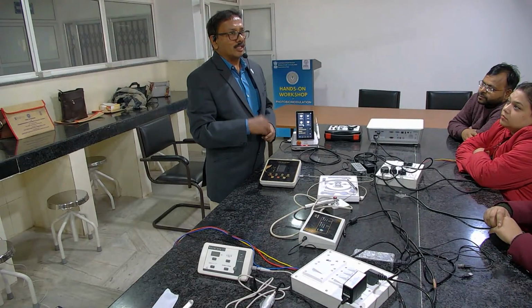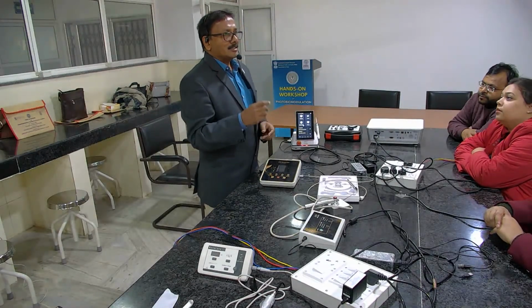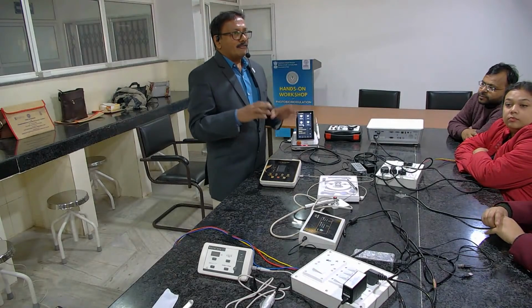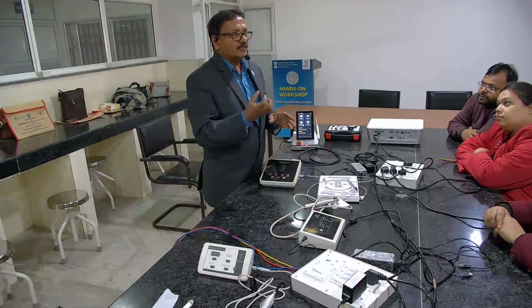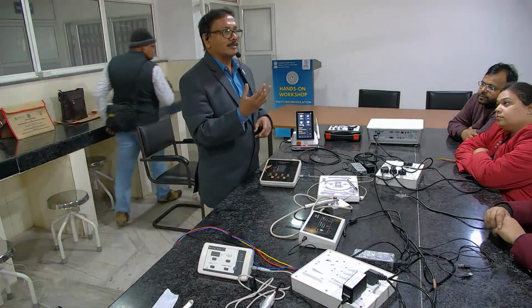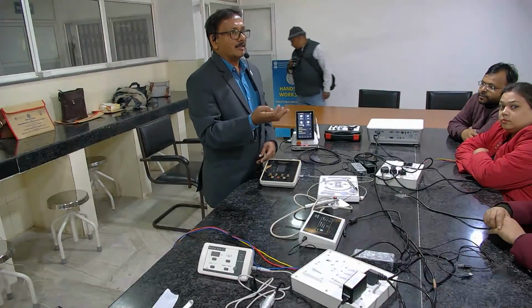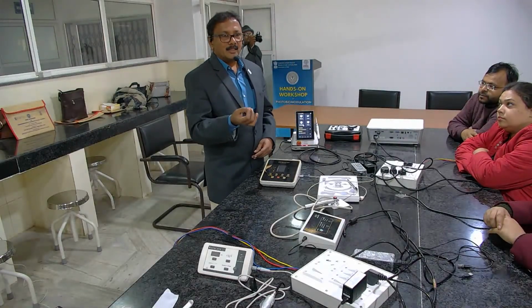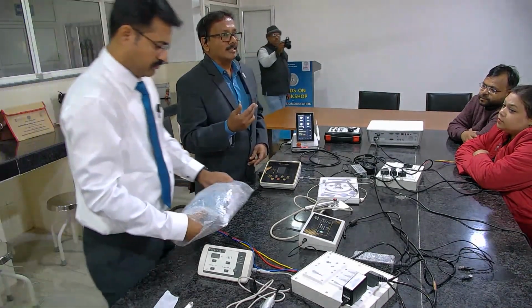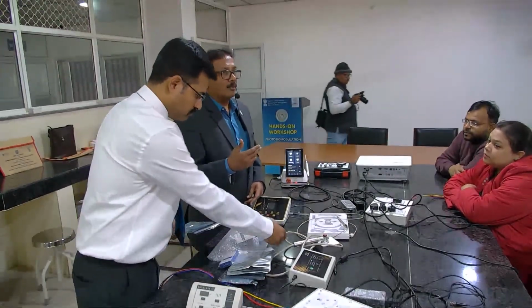After 4 minutes of soaking period, you just have to, am I visible? Yeah, you have to wait for the 4 minutes, right? Wait for the 4 minutes for the absorption of the dye to occur on the bacterial cells and viral or fungi, because photodynamic therapy is one that acts on all the three, be it bacteria, virus, or fungi. So you can ask me the question: why are healthy cells not affected, why only these bacterial cells or other micro pathogenic cells are affected? Because they are coated with lipopolysaccharides.